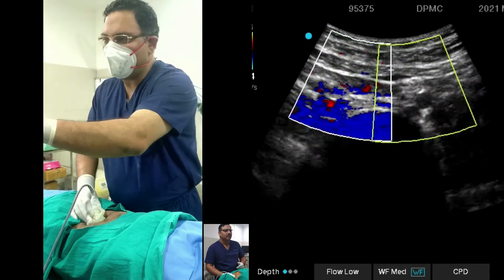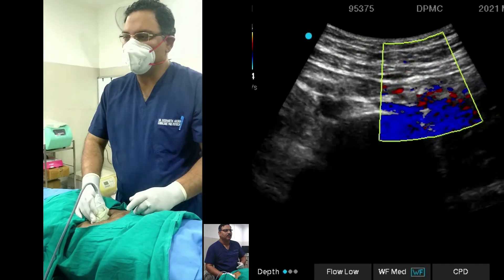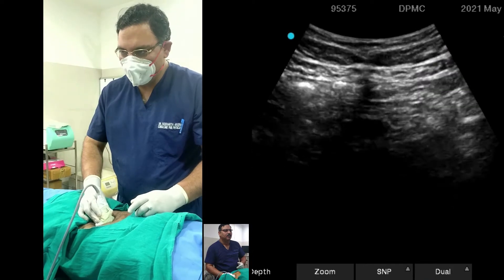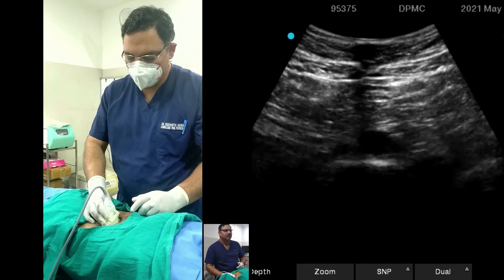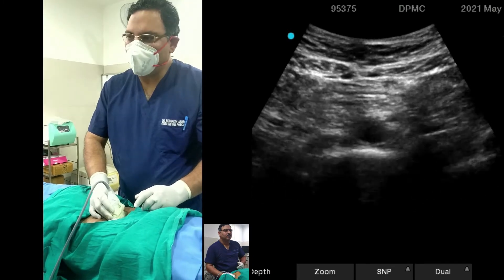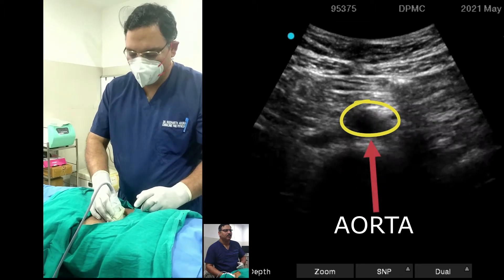You can do the color Doppler on both sides and check the iliac vessels. One more thing — as you go up toward the level of the umbilicus or around this area, it will again show the single aorta.